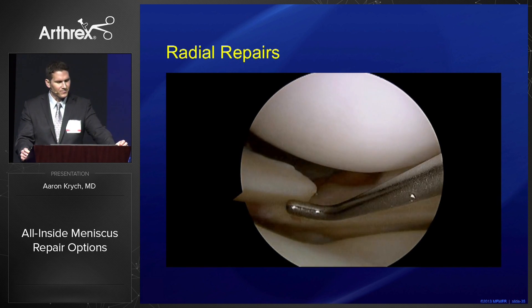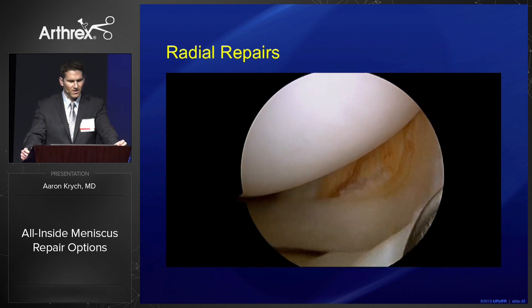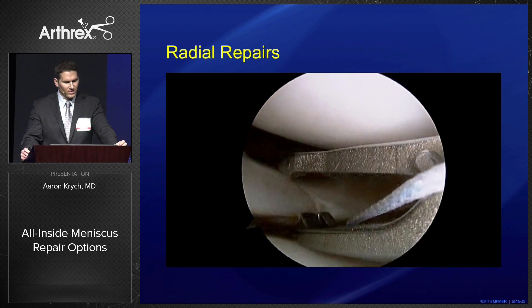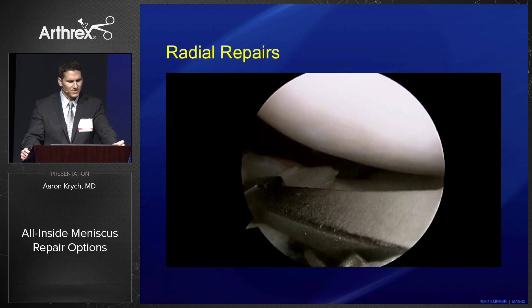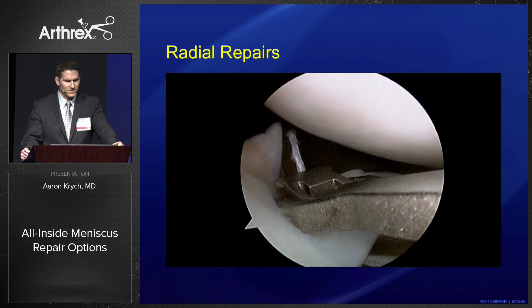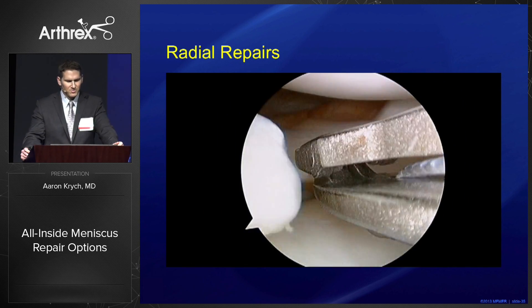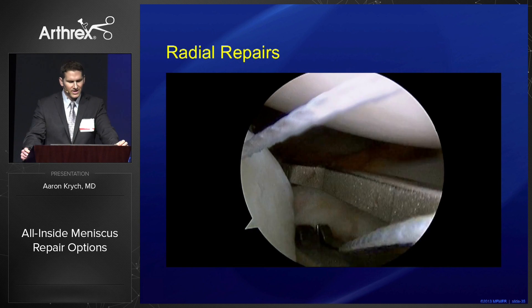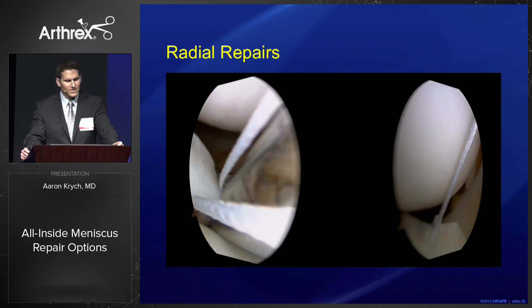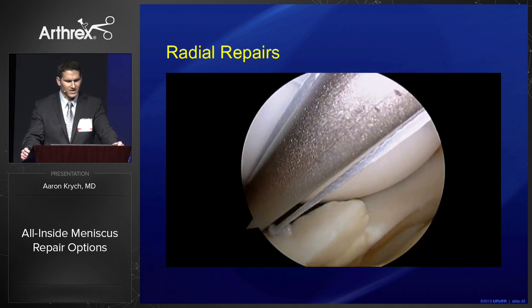What about a radial repair with the Knee Scorpion? Here's a patient with an ACL injury and a double radial tear of the lateral meniscus — the scorpion is a very nice option. We want to achieve anatomic reduction and circumferential compression. We place our first suture, and you can see the self-retrieving feature through the passport cannula. I also like it because you can very precisely place your next suture, allowing anatomic reduction of your tear, and you can actually feel the compression going through the tear as you're tying.